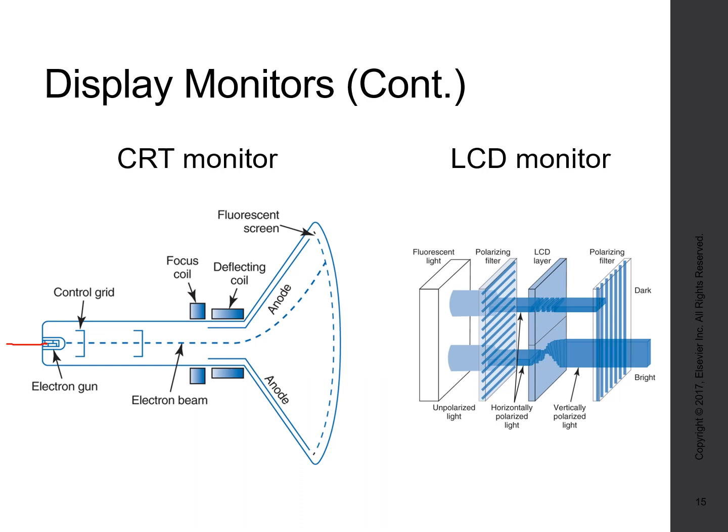The anterior screen is graphite in nature, but it has a posterior fluorescent screen. So when an electron hits that fluorescent screen, obviously it's going to glow, and so that's where you get the brightness coming through. So in this particular case, it's actually a black screen made to glow.